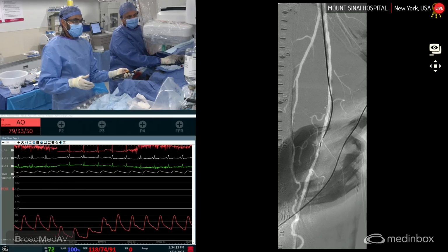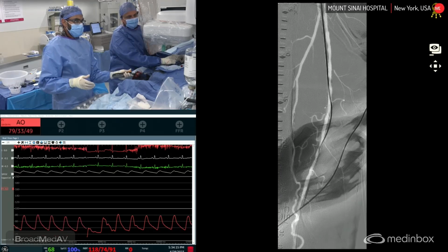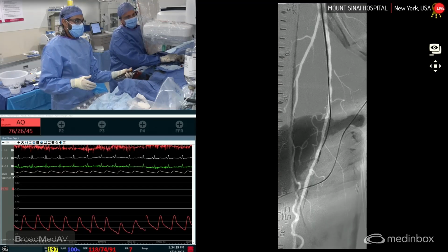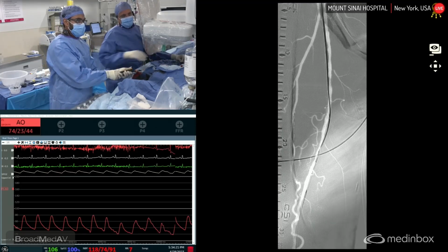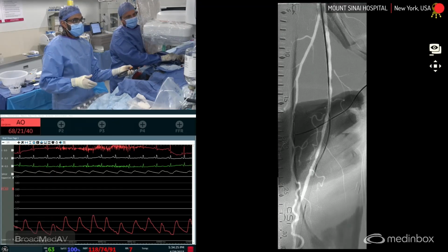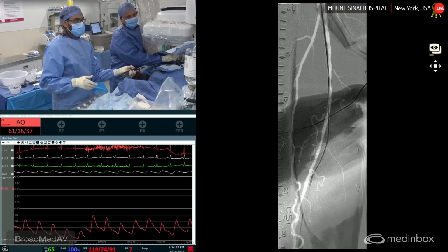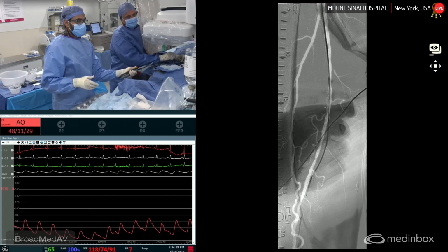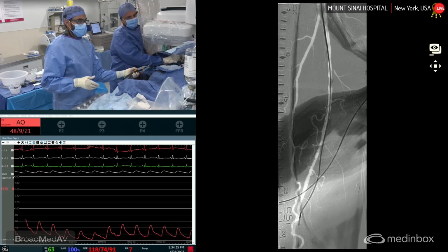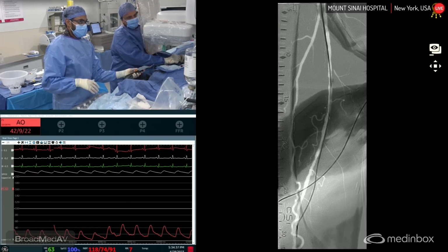You can tell by the change in the off. On again. Whoops, I'm lateral. Yep, I'm still lateral. On, please. One second, it's not packing. It's not locked. There you go. On. You can tell by the change in the cutter that I'm engaged. Off, please. And then down below. On, please. Off.